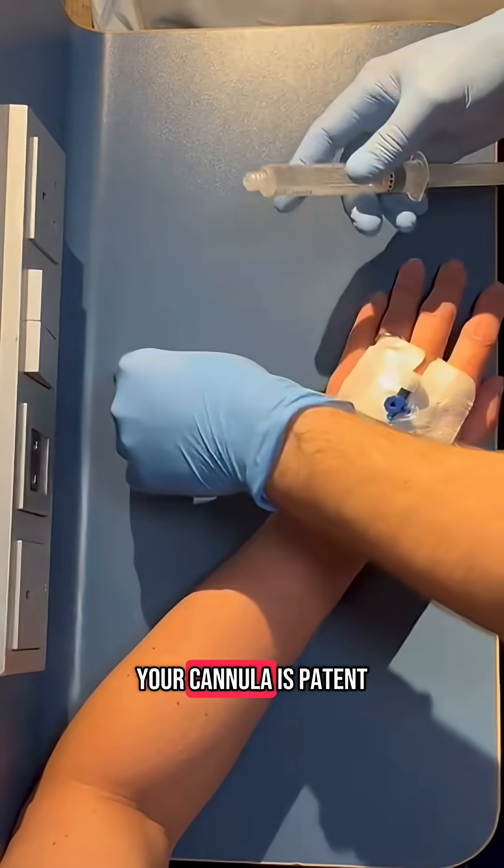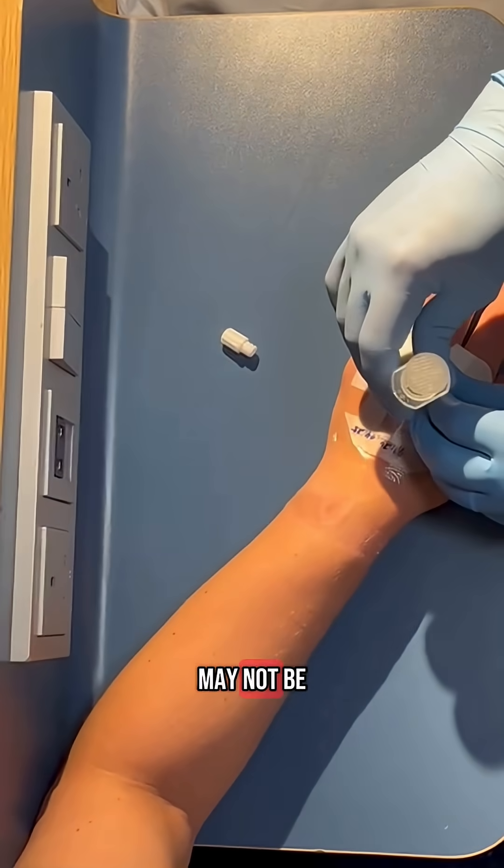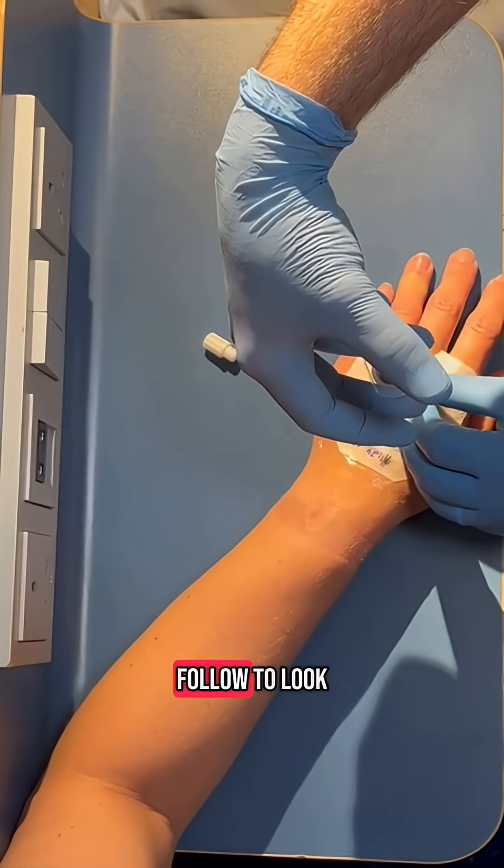Flush to ensure your cannula is patent and look out for complications, which may or may not be covered in other videos on this page. You should definitely follow to look out for them.